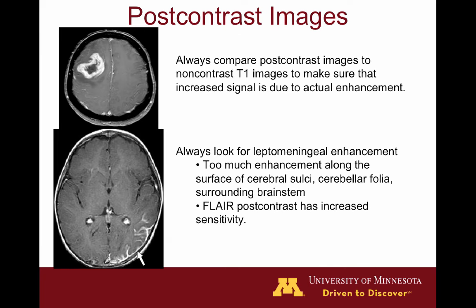Some words to the wise about contrast-enhanced images: you should always compare your pre-contrast with your post-contrast T1-weighted images, because many common mimics of enhancement turn out to be bright on the pre-contrast images. You'll always want to scrutinize the leptomeningeal space for abnormal enhancement seen with meningitis and leptomeningeal spread of carcinoma. Post-contrast FLAIR images are actually a little bit more sensitive than T1-weighted images at very low concentrations of gadolinium, so they're useful in subtle or very early cases of pathology.